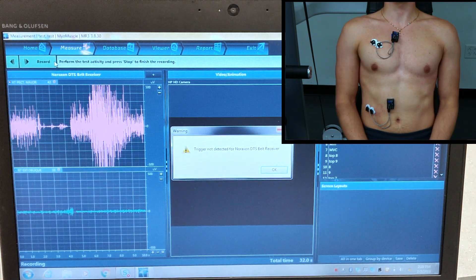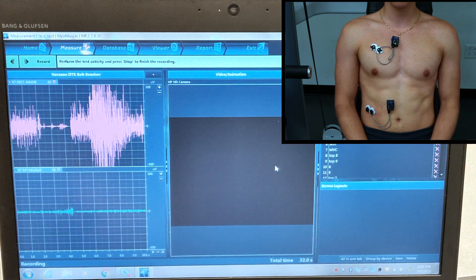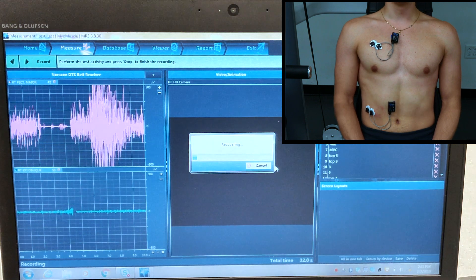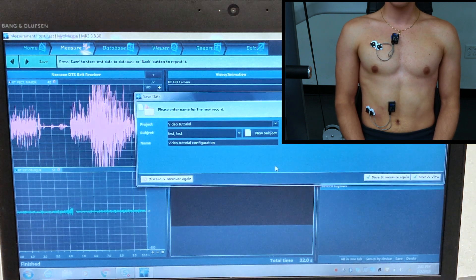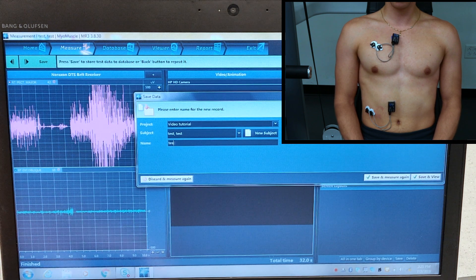We'll hit Stop, which will save our data. We'll wait for the Save Data screen to come up, and we'll label this one Test Four Reps.